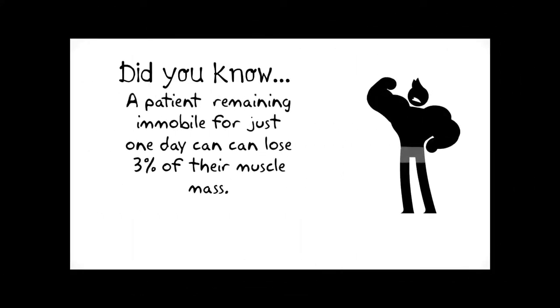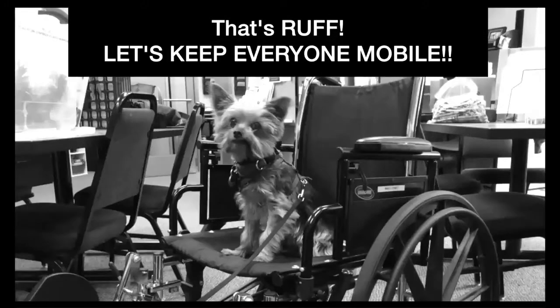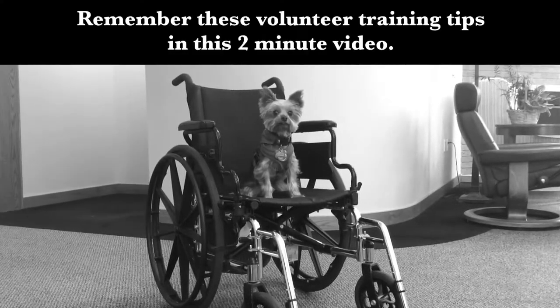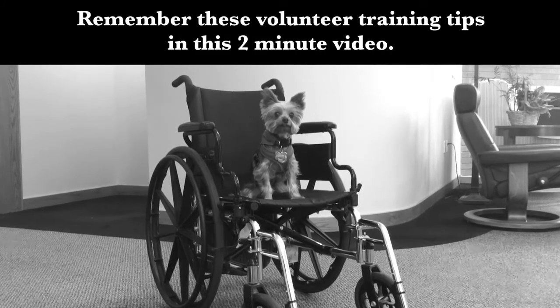Did you know a patient remaining immobile for one day can lose 3% of their muscle mass? That's rough! Let's keep everyone mobile! But before we do, remember these volunteer training tips in this two-minute video.